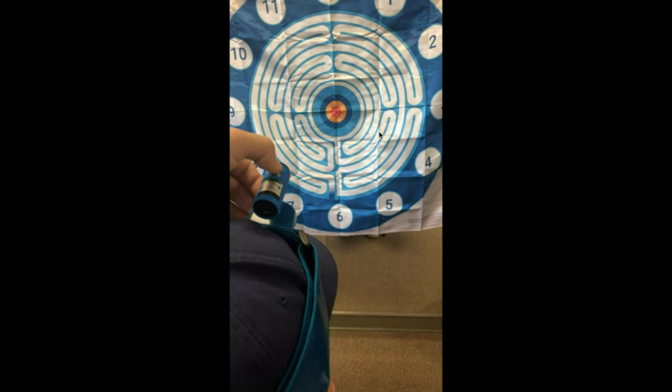So if I do 3 tests and all 3 are outside the standard deviation, I can go ahead and move on from that. Now, if I do 4 tests and they're all inside the standard deviation, I can also stop testing, because that's not going to yield 3 positives for outside the standard deviation, and those would be considered negative testing.